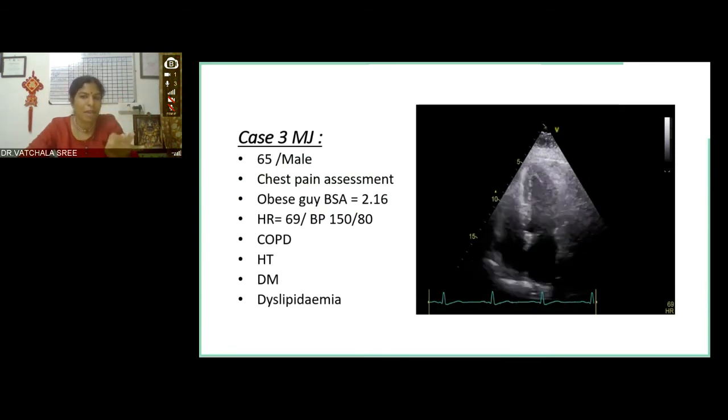AFI will definitely help, reduced strain will definitely help. But I think these 2 are more important than AFI. And obviously you can also do an AFI before the stress and after the stress also. That also will help you.